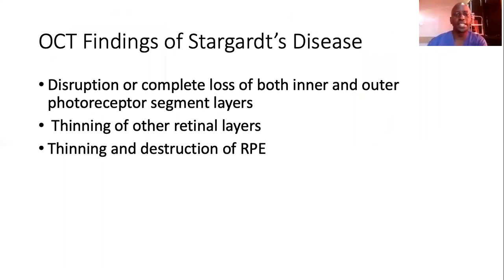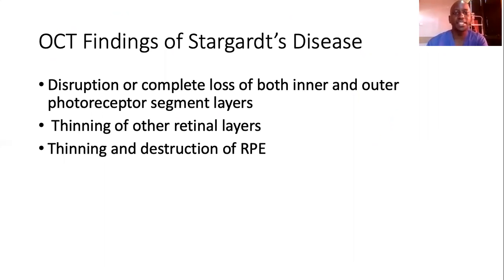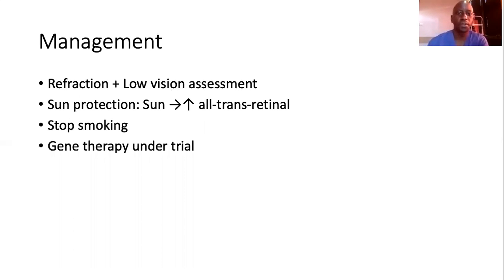In summary, the OCT findings of Stargardt's disease are quite characteristic. As cases get worse, you have more and more disruption of the retina, involving both inner and outer segments of the photoreceptors. In more advanced cases, you have thinning of other retinal layers, and in very advanced cases with destruction over many years, thinning and destruction of the retinal pigment epithelium and into the inner layers of the choroid.